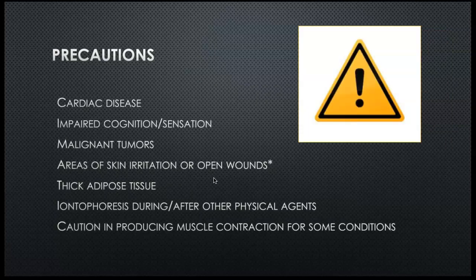Precautions, just be careful. People have cardiac diseases because you are changing circulation. And if somebody has some sort of reason where their heart can't keep up with this new increased circulation, you need to be aware of that. So it's a precaution. Doesn't mean all people with cardiac disease. It just means certain people. You need to know some more detail about their cardiac disease, right?